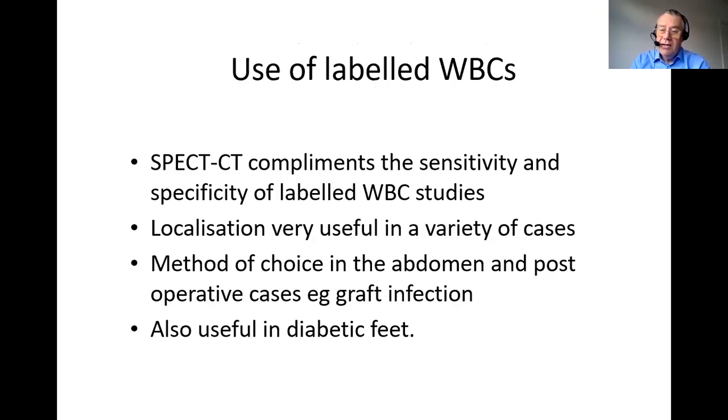We use labeled white cells now in the UK. It's traditional for us to label white cells with technetium HMPAO or indium oxine. In other countries, you use Sulesomab, which is a technetium labeled antibody. But again, it doesn't matter which of those techniques you use, SPECT-CT is very useful. And again, it's because you get really good localization. And we found this particularly useful in diabetic feet.